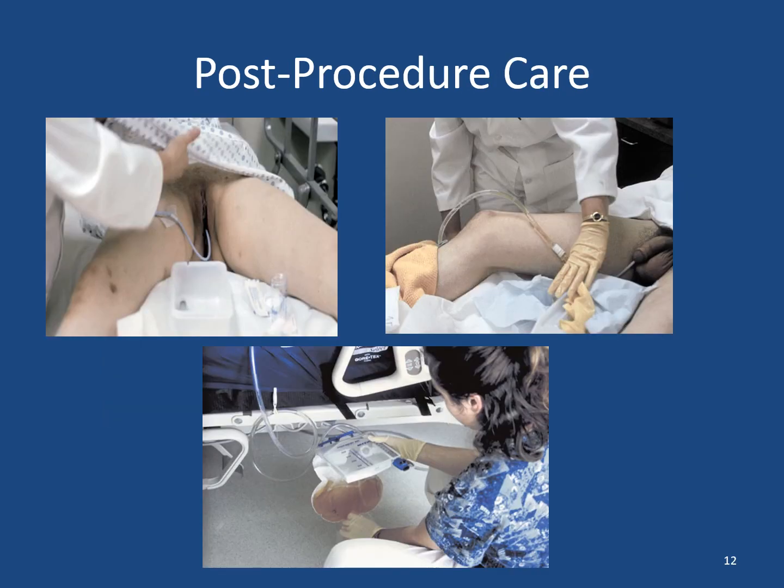Okay, post-procedure care. We would want to tape the catheter or use a commercially prepared device to fasten it to the leg. A lot of times they have little clips that you can actually hook onto the client's leg, stat locks that help hold it in place. What this does is it prevents movement of the catheter inside the body. The more the catheter is moving, the more irritation you're going to have. It's going to pull, it's going to be uncomfortable, and it can actually cause inflammation on the skin at that site.